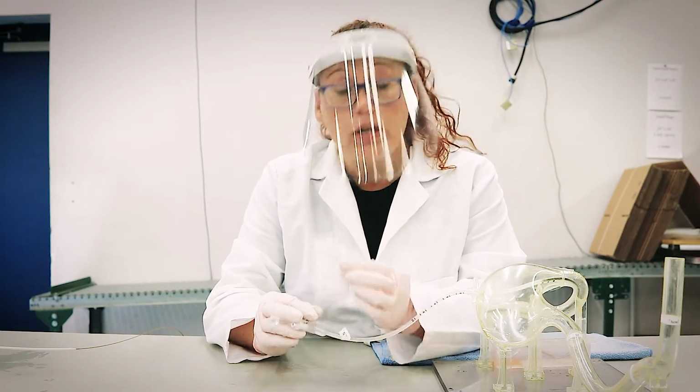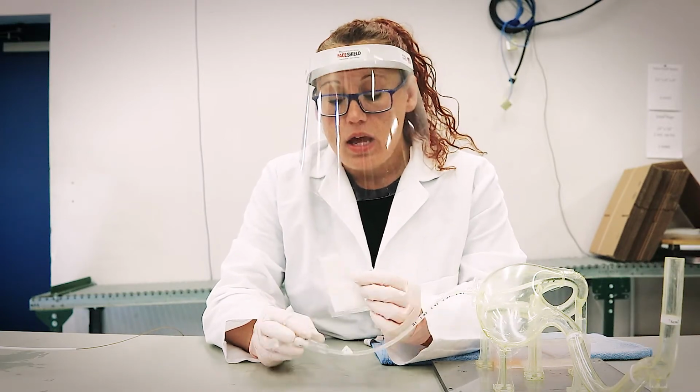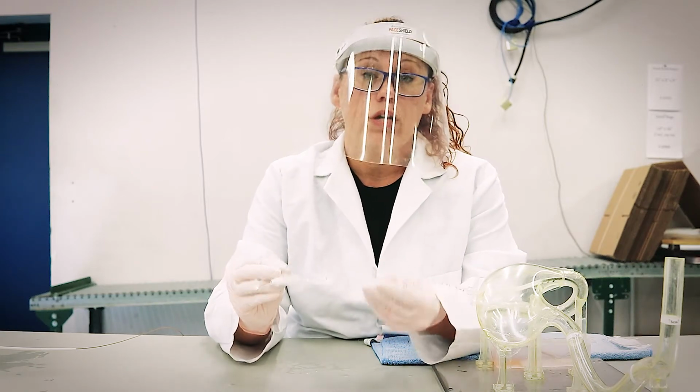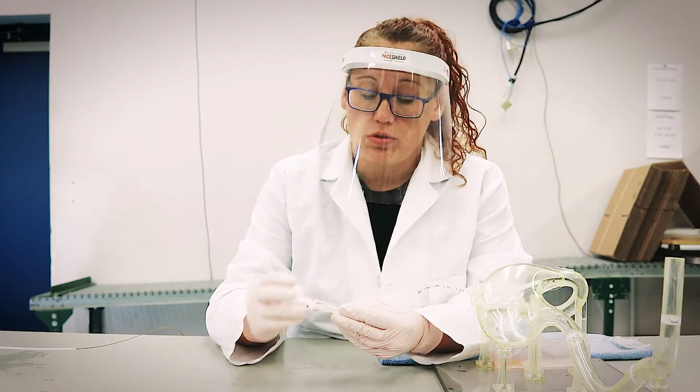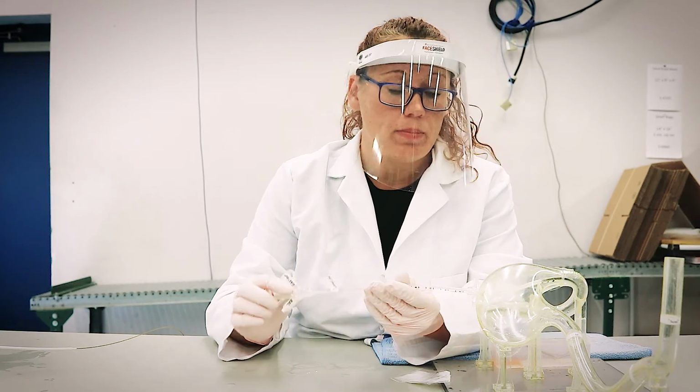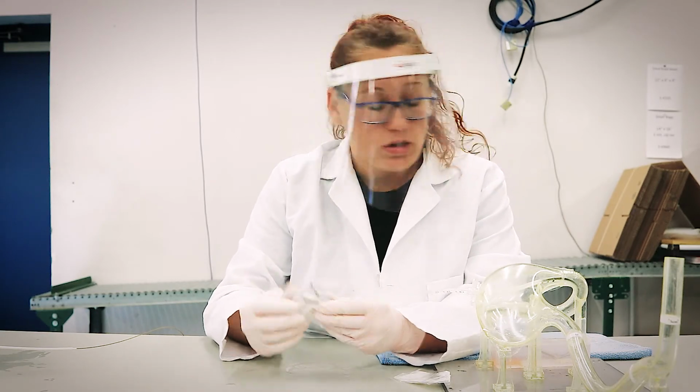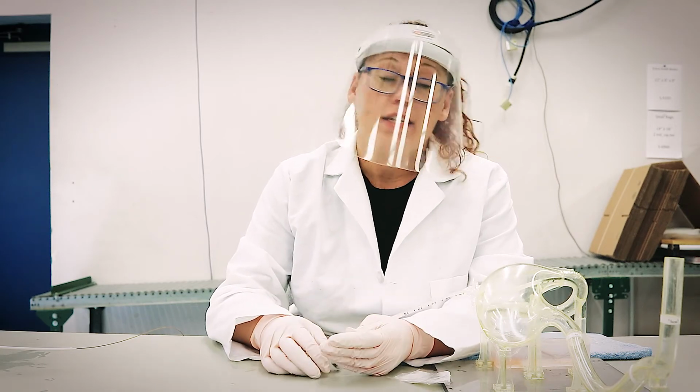Always frequently lubricate, and sometimes it's good to only go in for a minute or two, take it out, relubricate, a minute or two. That's what will keep this effective. That's just some tips and tricks, and it's different every time.